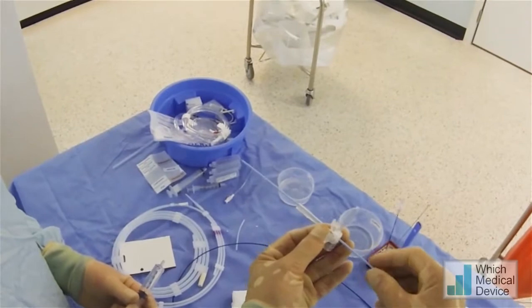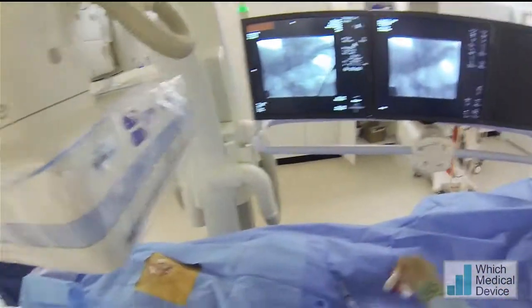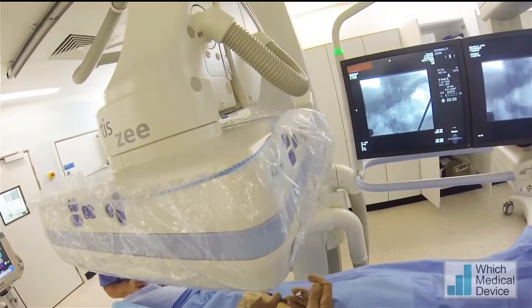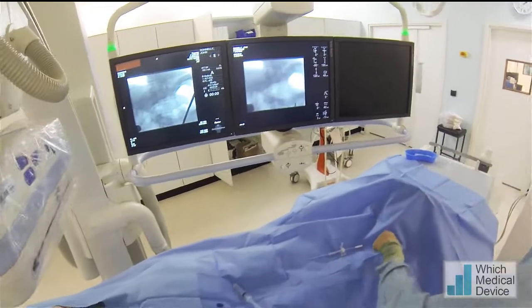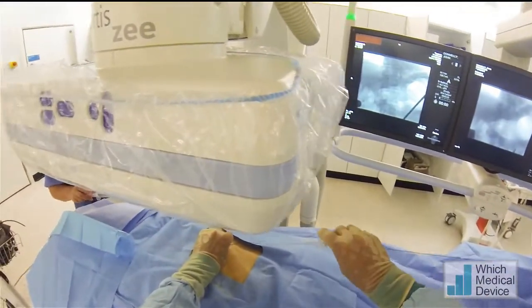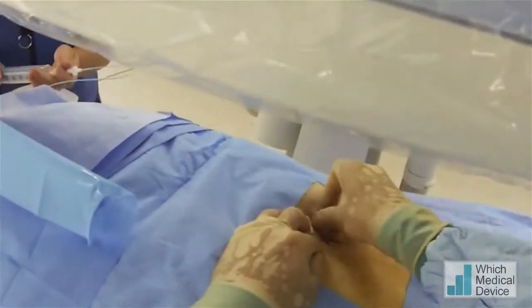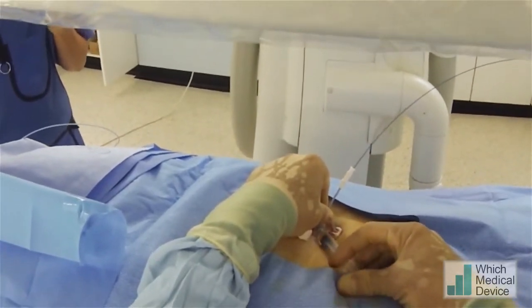This 7 French dilator will give it a little bit more rigidity when we insert it. We're just taking the dilator out, leaving the wire in. We're going to put a bit more air into the stomach to make sure we've got maximum gastric distension to help insert the gastrostomy. Now a bit of firm pressure. Keeping forward pressure on the gastrostomy whilst inflating the balloon with one mil of contrast and four mils of water.